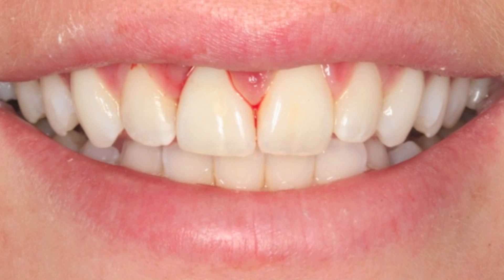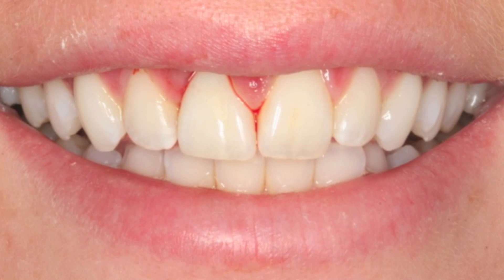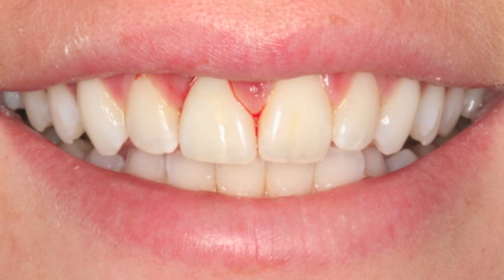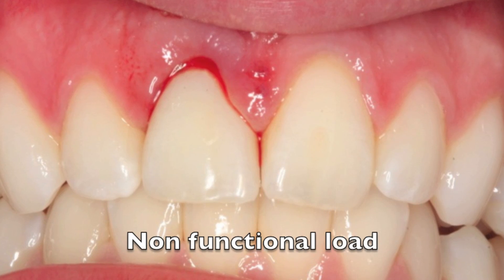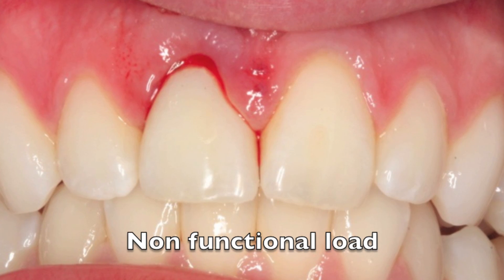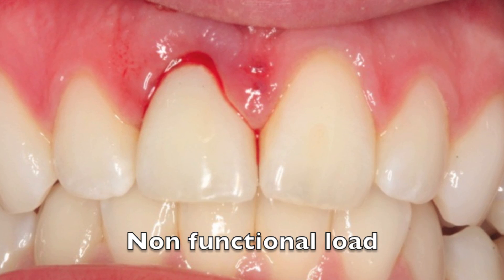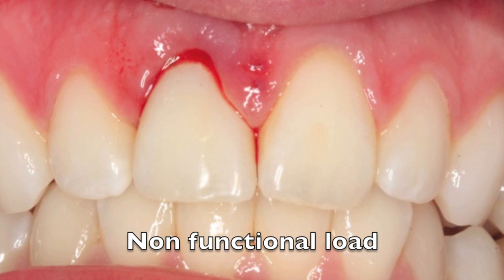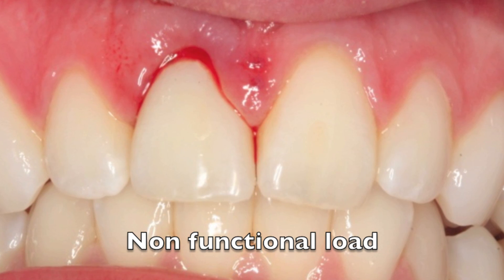After about an hour procedure, tooth is out, root is out. We're able to get a nice temporary that looks exactly like what she had when she came in, so the patient is thrilled. She understands that the gingiva and gums around the area are going to be a little red for a few days.